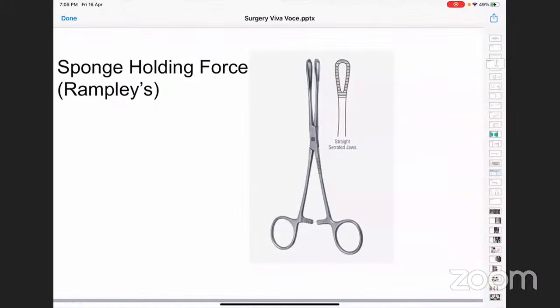And then what is the speciality of the tip here? The tip has two jaws. The jaws have a sort of teardrop shaped fenestration. And then at the tip, you can also see transverse serrations. This will help you hold the sponge. So any surgical sponge can be held with the jaws. And once you hold the sponge or the tissue, it can be locked using the ratchet.